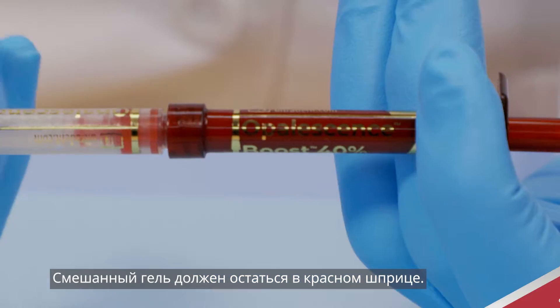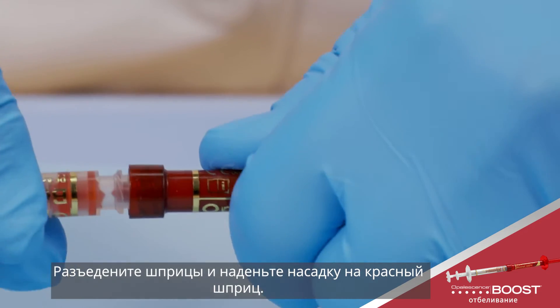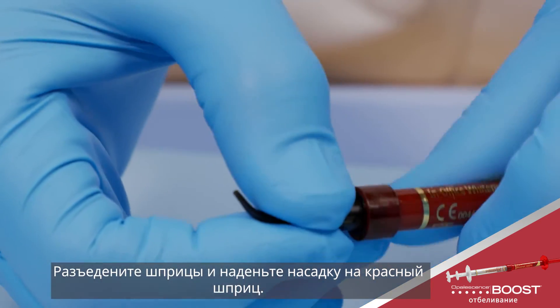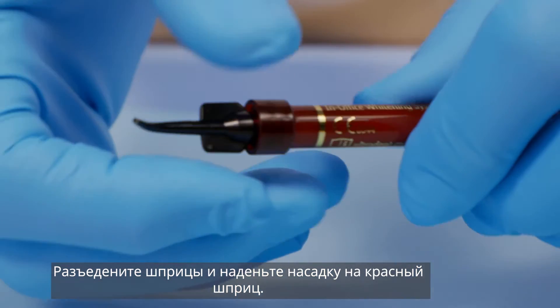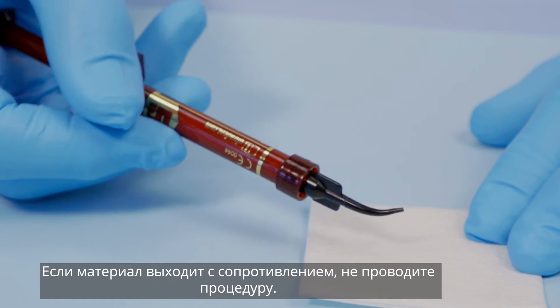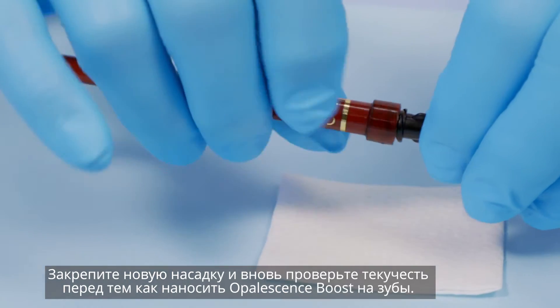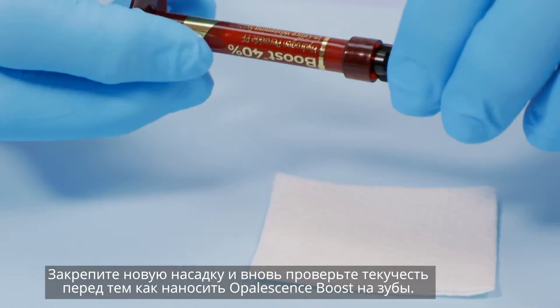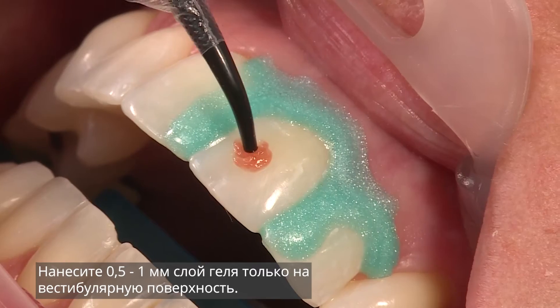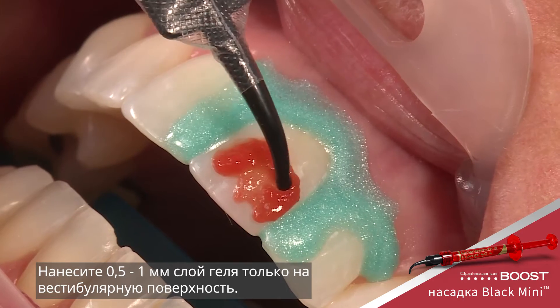Press all mixed gel into the red syringe. Twist to separate the two syringes and securely attach tip. Verify flow prior to applying intraorally. If you feel any resistance, do not proceed. Attach a new tip and test the flow again before applying Opalescence Boost whitening gel to the teeth. Apply a 0.5 to 1 millimeter thick layer of gel over the labial surface.